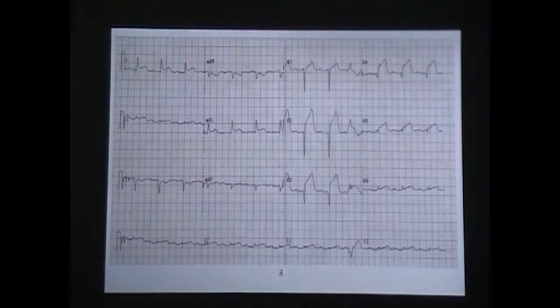Anything I can answer back there? You guys good? I was just asking what makes the trend of like 2 and 3, how it's trending downwards. What do you mean by trending down? The baseline or the isoelectric line? Yeah, it's not a good isoelectric line. What makes it do that? It could be something as simple as poor lead placement or adhering to the skin. Because everywhere else I'm pretty good. I've got a pretty nice isoelectric line. Maybe the lead isn't on that well.